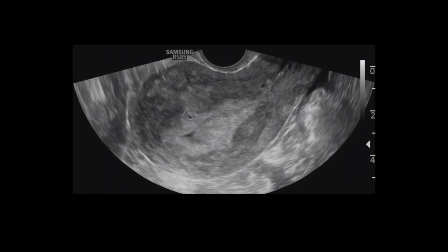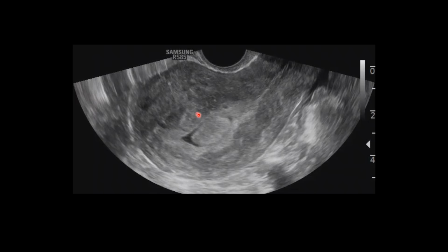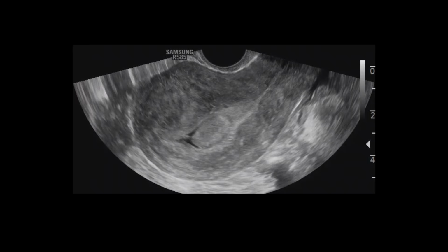Well, notice that the myometrial echotexture is heterogeneous, and then the margins of the endometrial myometrial interface are ill-defined and striated with these echogenic tendrils of endometrium insinuating into the myometrium. We also have these scattered subendometrial or myometrial cysts at this endometrial-myometrial junction, and that's typical for adenomyosis, which can also cause pelvic pain and abnormal bleeding. And if you want to learn more about that, please see my prior lecture on ultrasound of adenomyosis.